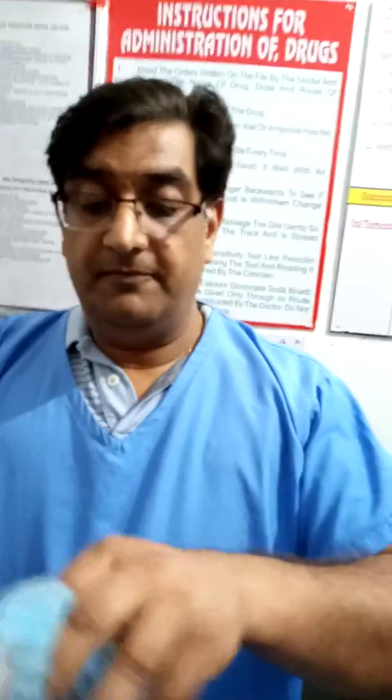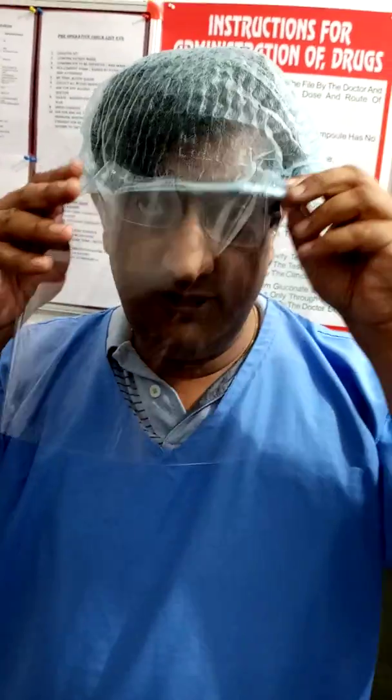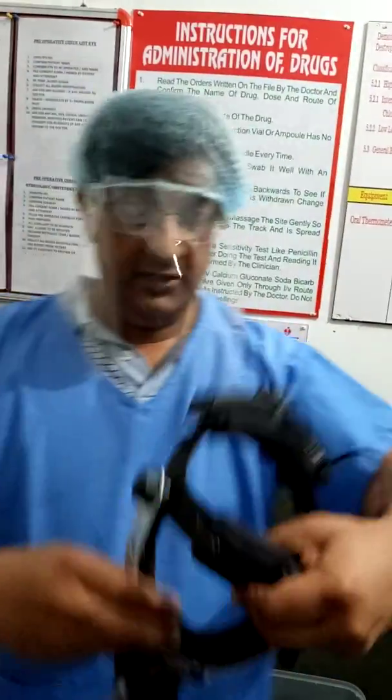The net result is a mask like this, which you can wear very easily over your face. It also allows you to wear an indirect ophthalmoscope right over it.